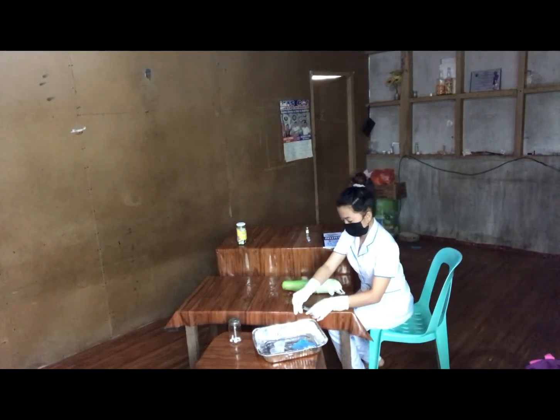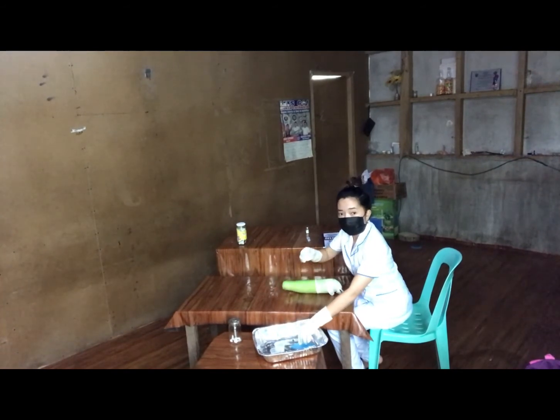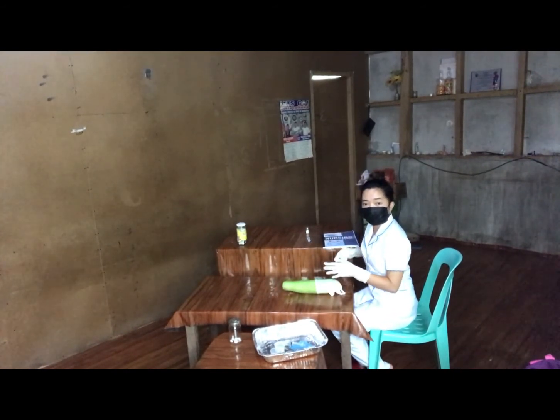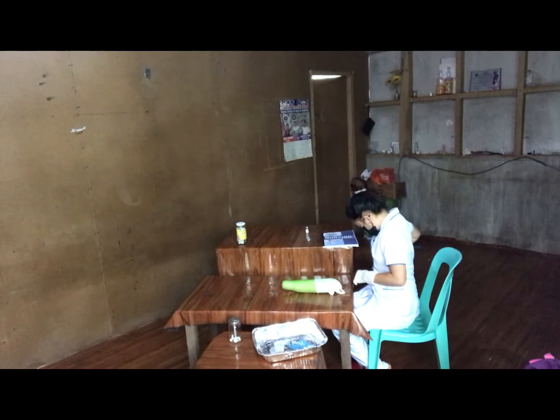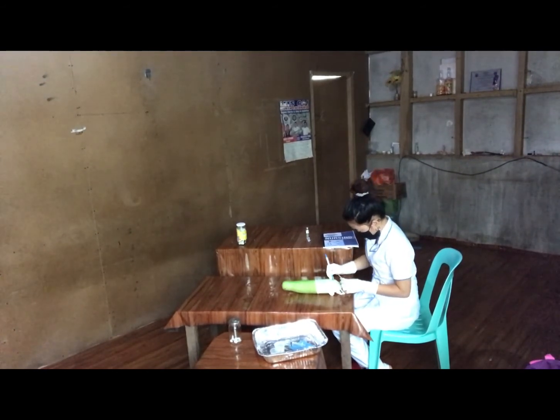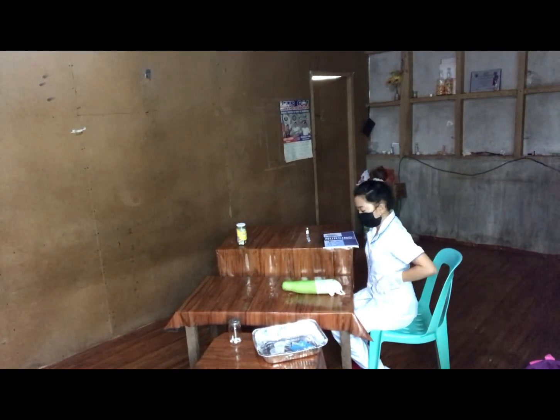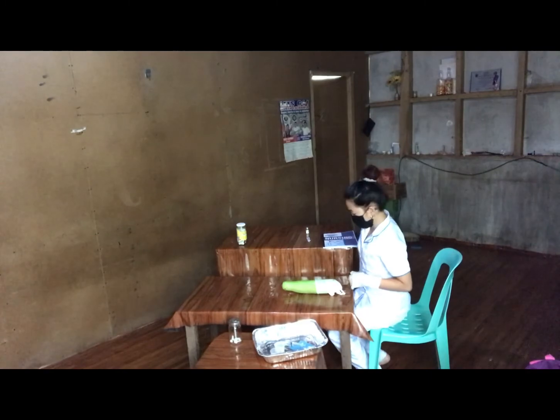I will throw this to this side. And now I will encircle the site of injection. That's all for the parenteral administration using the intradermal and intramuscular. So that's it for my presentation.